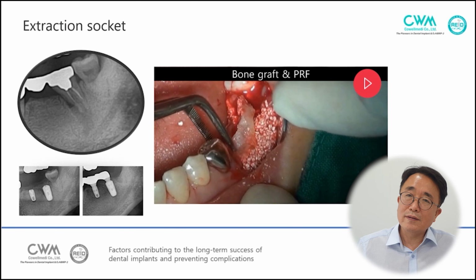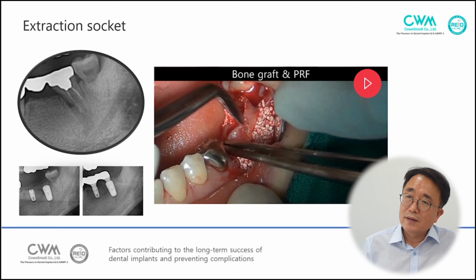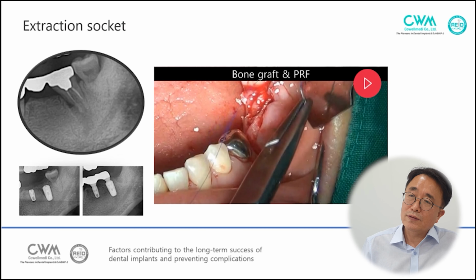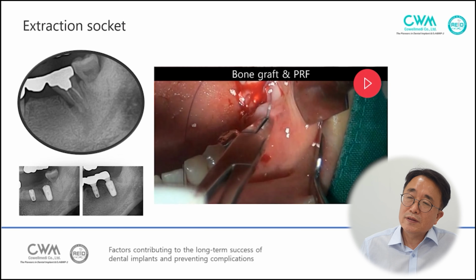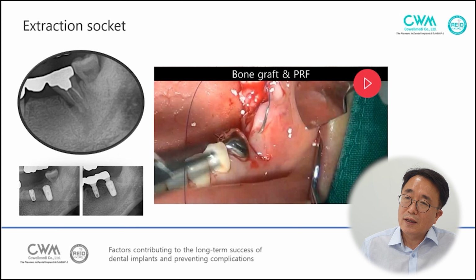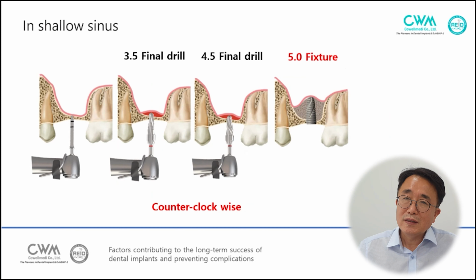And the gingival thickness was decreased, narrow. So for thick gingival thickness, I inserted a PRF graft on the plate.